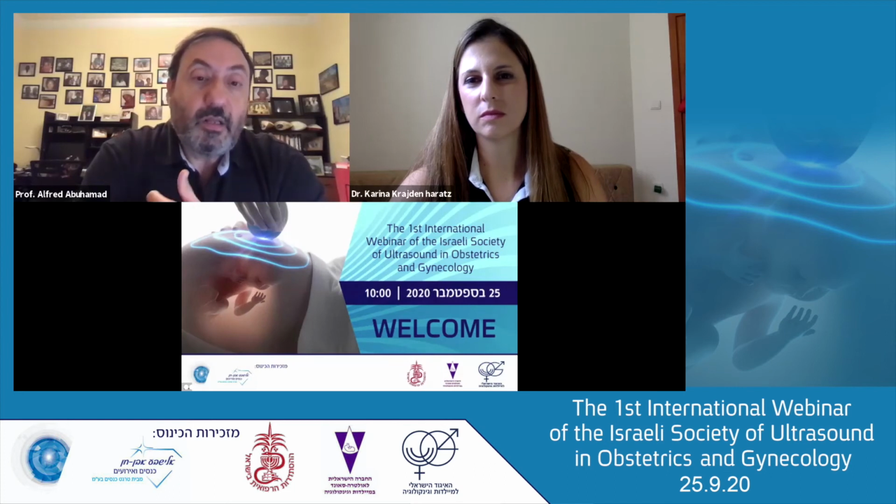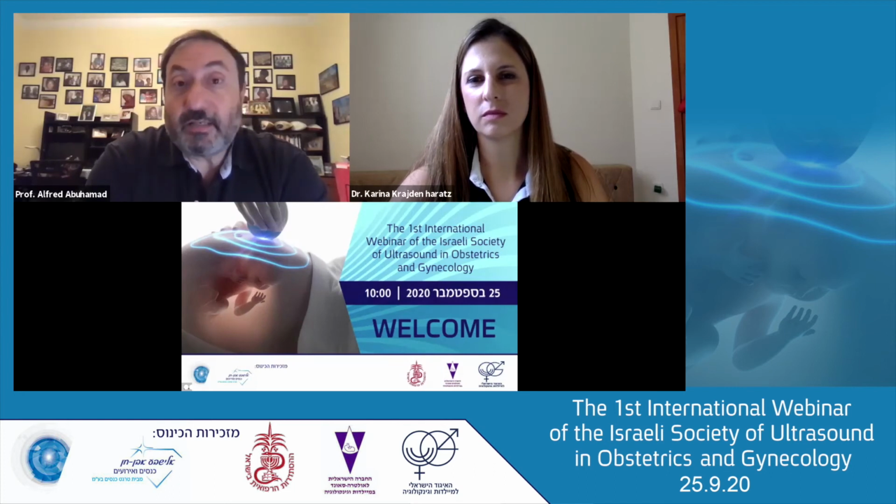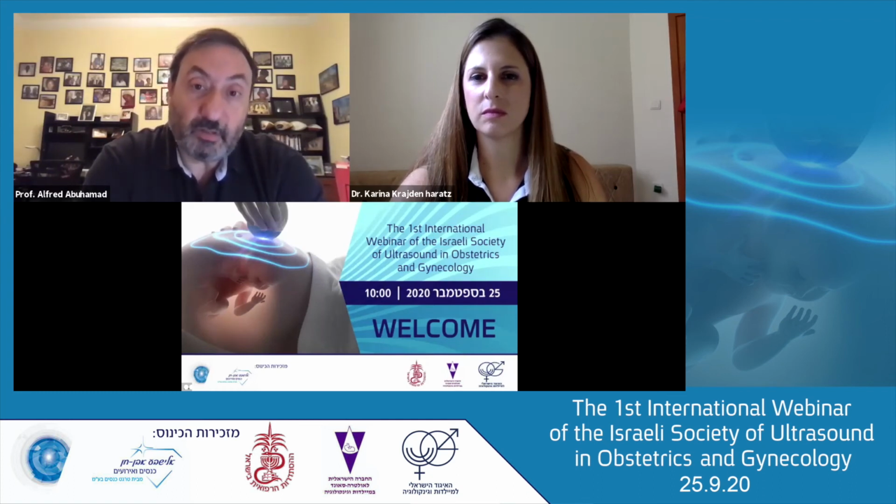Now, most of our exams are done transabdominally, and we are able to do this cardiac screening in the first trimester transabdominally in more than 90% of the time.